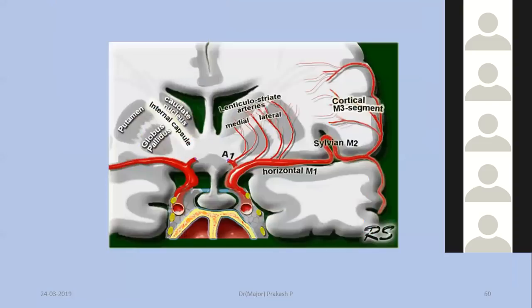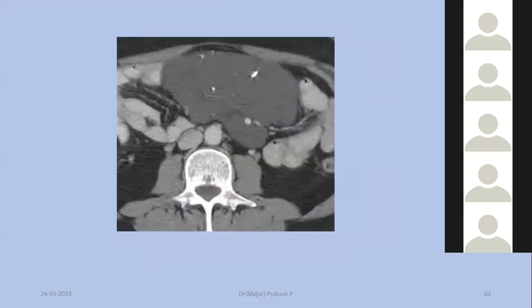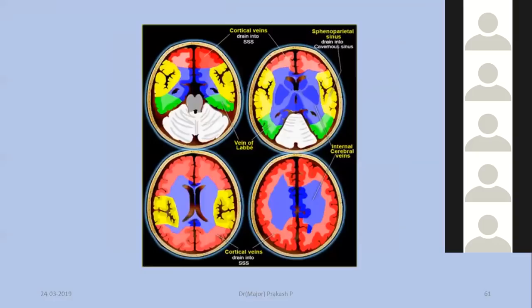Okay, so you look for the narrowings in these areas like this. You have to look in the coronal section for any narrowing, and look for any lenticulostriate arteries if you can. Ideally, a DSA is preferable in these cases to look for narrowing. Since you have completed the arterial anatomy, I will also suggest that you learn about the venous anatomy. So with this, we have completed the four cases which I had scheduled for today.